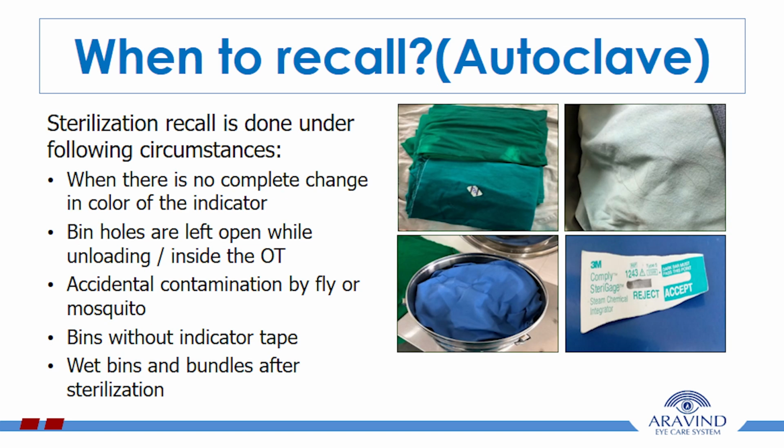What is sterilization recall? Whenever sterilization doesn't meet its requirements, all packs sterilized in that cycle are called back from the respective area where it has been supplied. The packs called back are sent for re-sterilization using a proper machine.